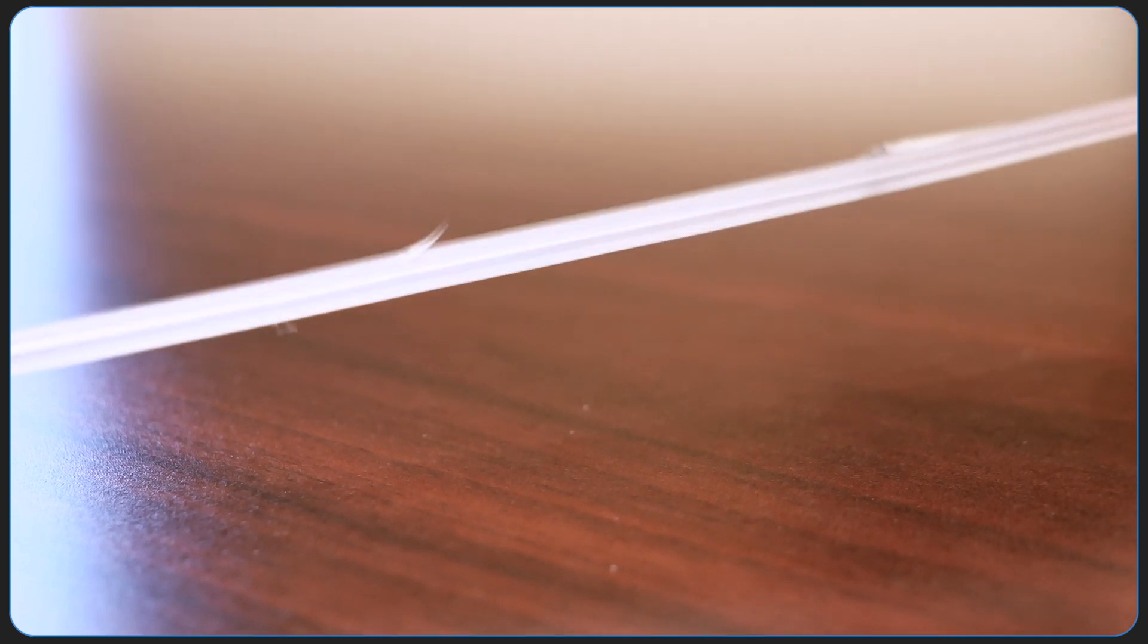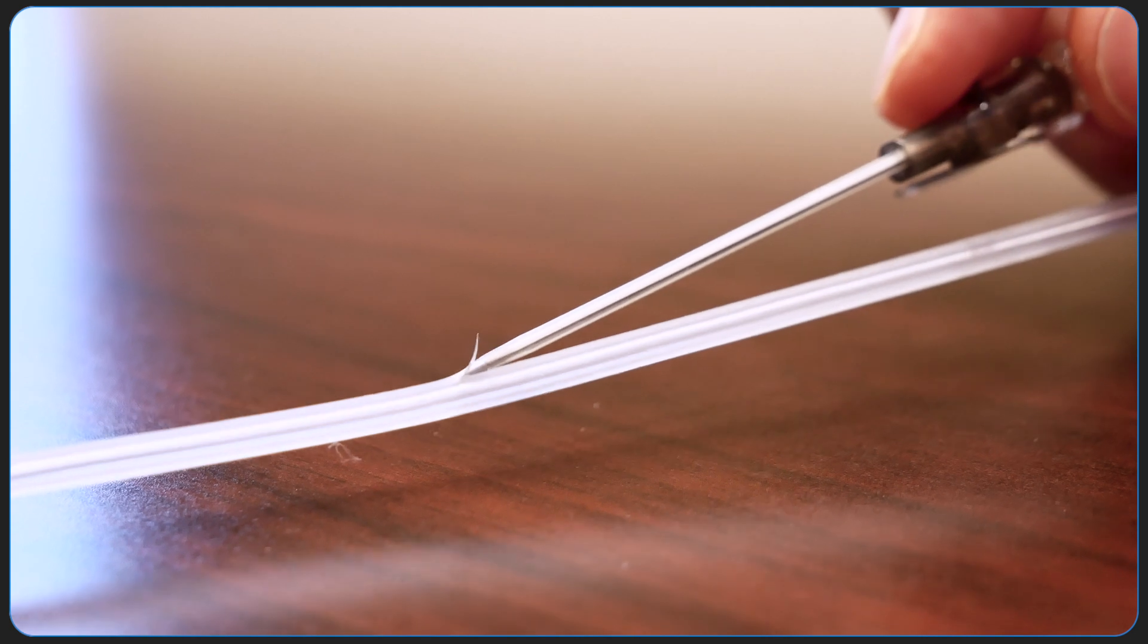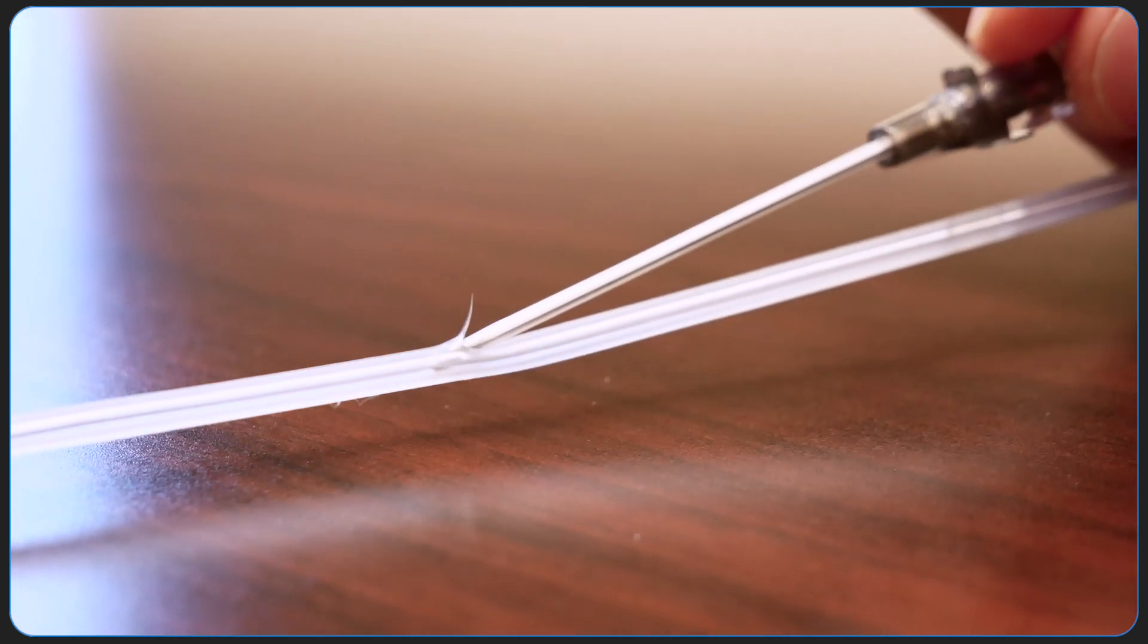The way you avoid mistake one is by making sure you advance your needle more. But that can get you in trouble with mistake two.